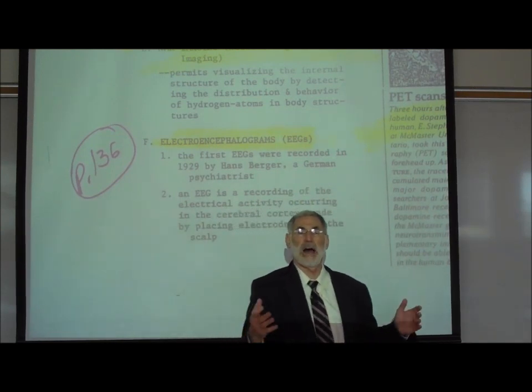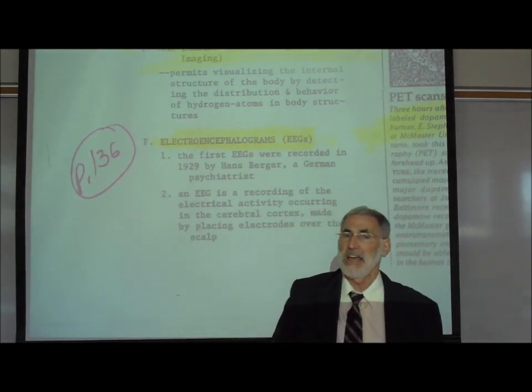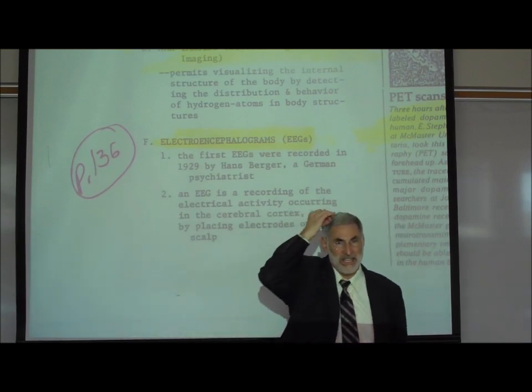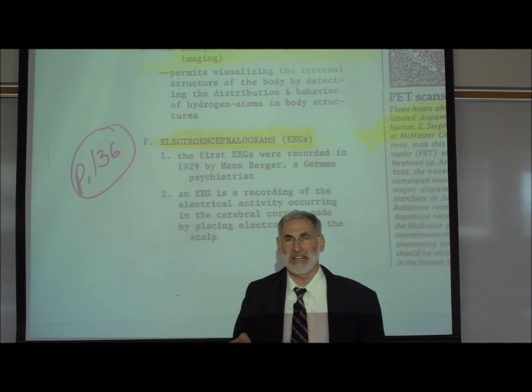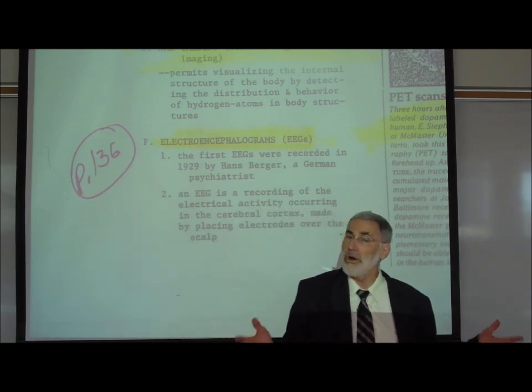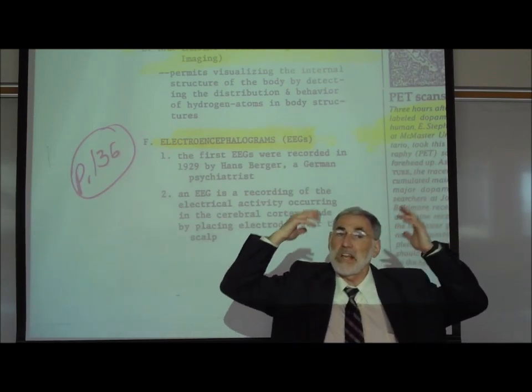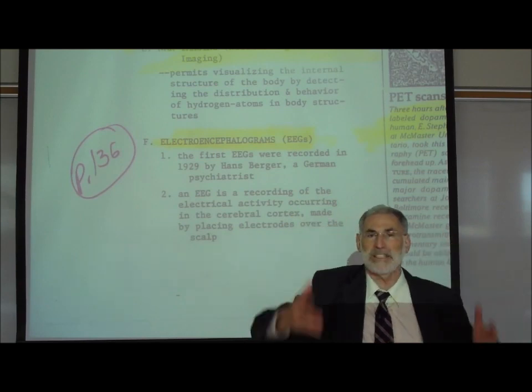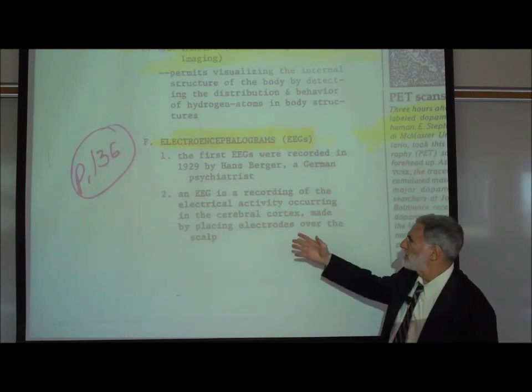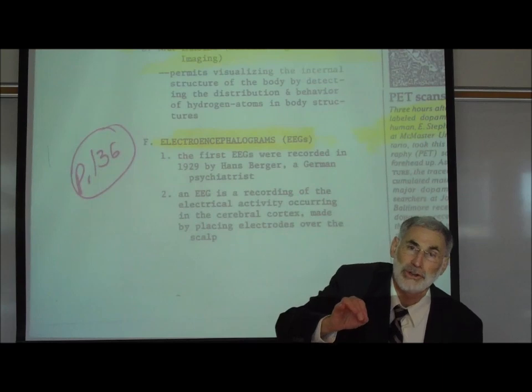This is where electrodes are placed on the scalp, on the surface of the head. An electrode is simply a metal contact or a little sticky gel that conducts electrical current, very similar to what's used to record an electrocardiogram of the heart. And this is used to record the sum of all the electrical activity occurring within the brain at any moment in time. So when one records this EEG, you're not recording the action potentials of a single neuron.